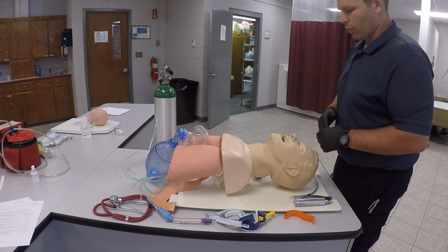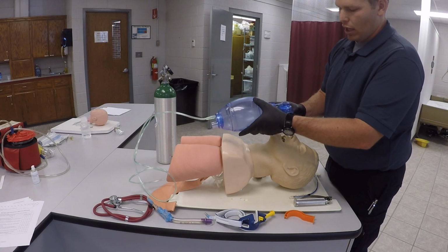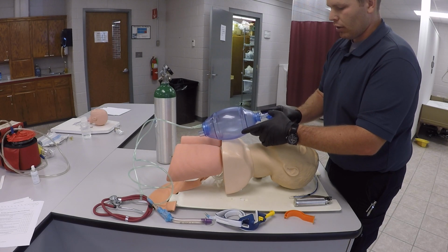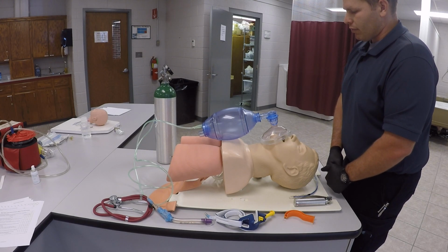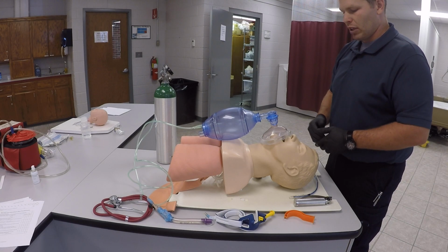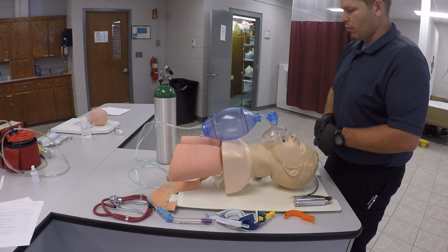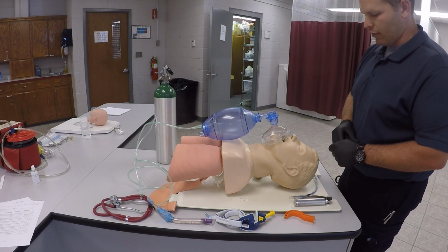We're going to have our partner start pre-oxygenating the patient using a BVM, high flow O2, at a rate of 10 to 12 breaths per minute, and just kind of working with the patient at their regular rate and assuring adequate ventilation there. Next thing we're going to do is take our SpO2 and make sure we're monitoring that. If we can get CO2 readings and ECG readings, we'll monitor those as well. And then we'll prepare our equipment and make sure one of our partners is getting a patent IV established for us.